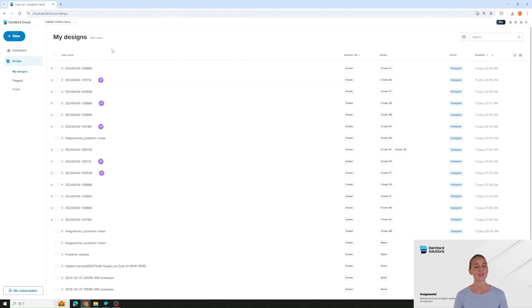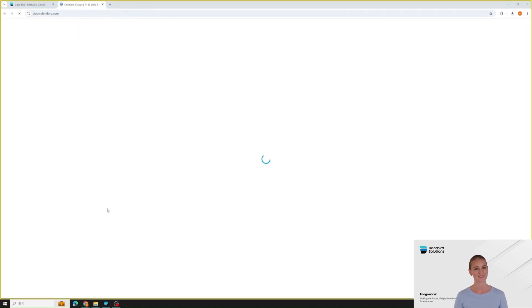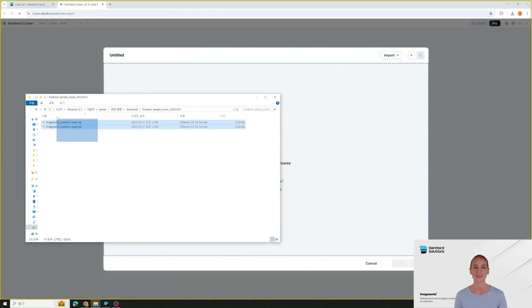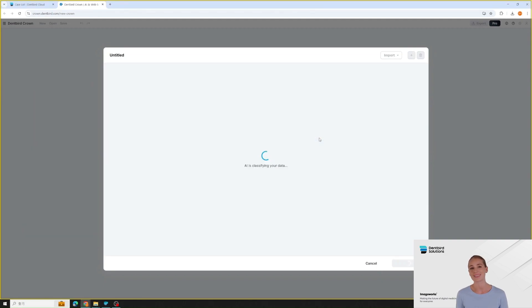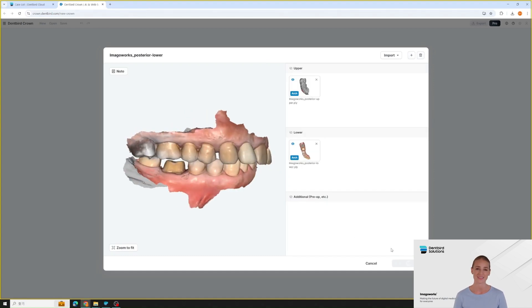Let's upload a case. With DentBird, there are no complex order forms. Just enter a name for the case, drag and drop the scan data, and there — as soon as you upload the scan data, DentBird automatically detects the upper and lower arches. Now we're ready for some AI design.